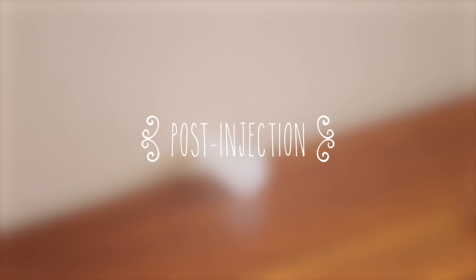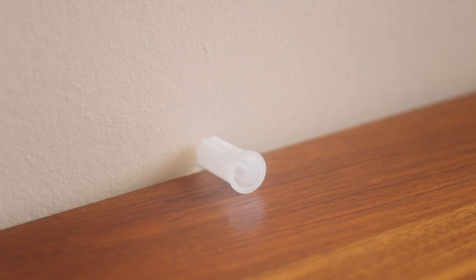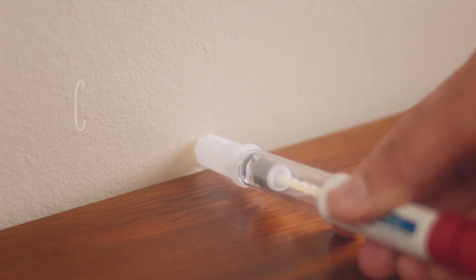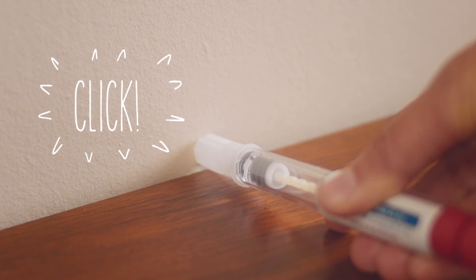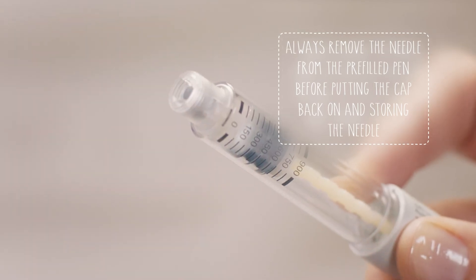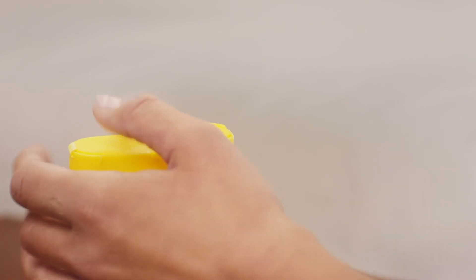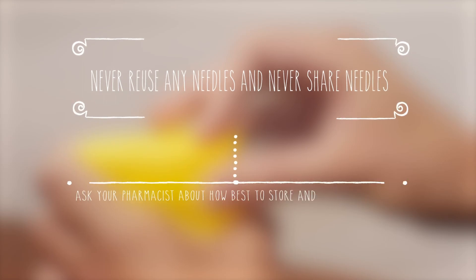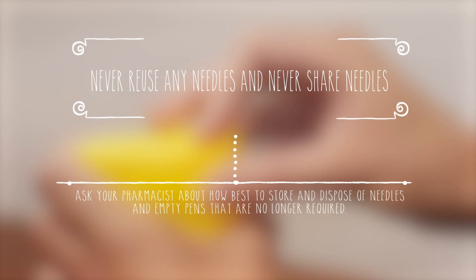Now you've finished, you just need to take the needle off and put the pen away. First, put the outer needle cap on a flat surface. Then holding your pen with one hand, very carefully push the needle into the outer needle cap. Push it against a firm surface until you hear it click. After it's clicked into place, pick up the outer needle cap and unscrew the needle by turning it anti-clockwise. You can then throw away the needle cap with a used needle inside. Now you can put the pen cap back onto the pen and store it in a safe place away from sunlight, or in the fridge if you prefer.